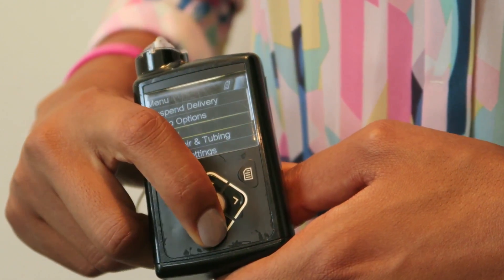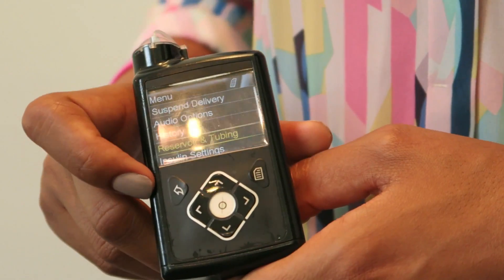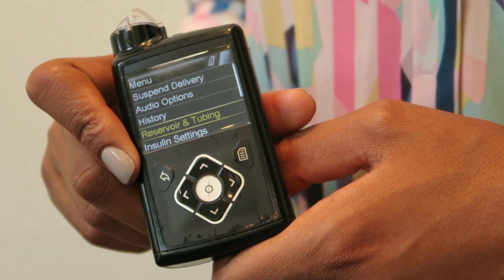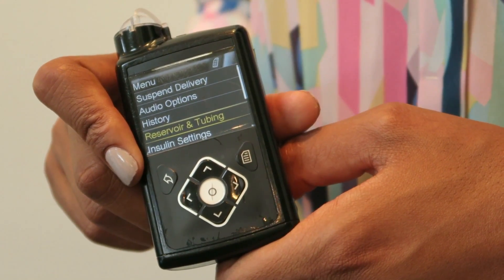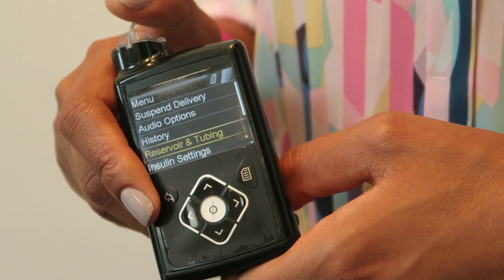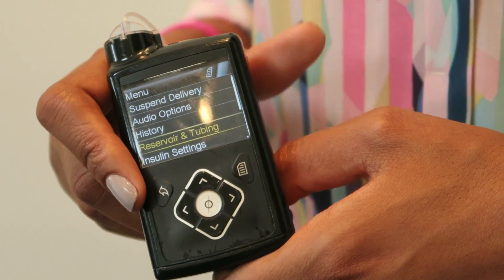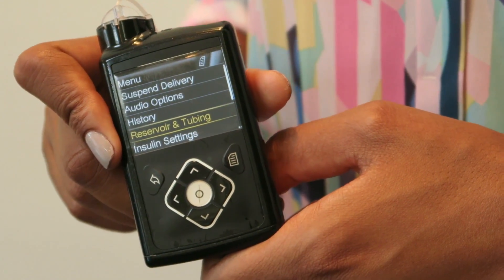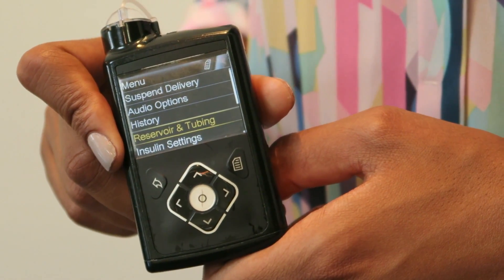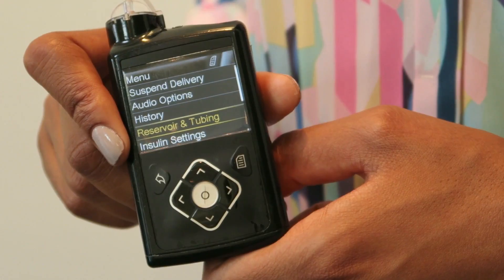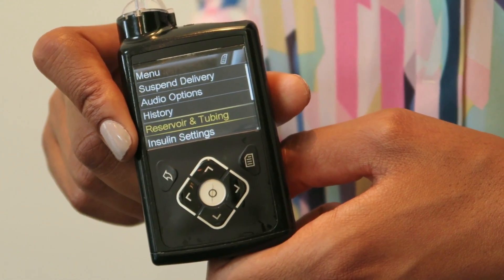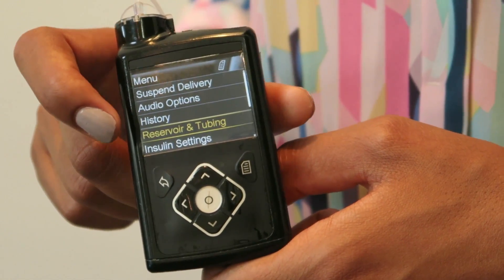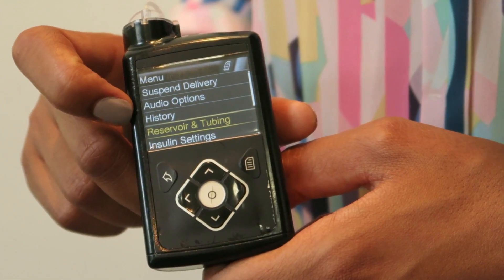We've then got the reservoir and tubing option. The reservoir is the part of the pump that holds the insulin, which delivers it through the tubing. If you need to change those or top them up because your insulin has run out, that's the option you need.